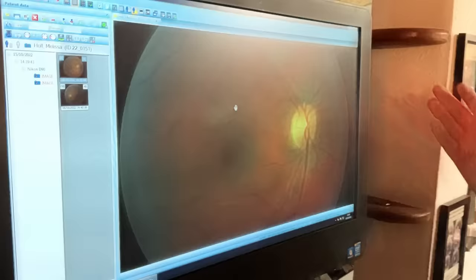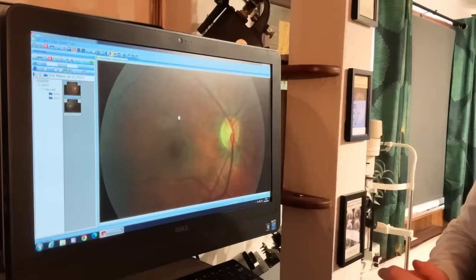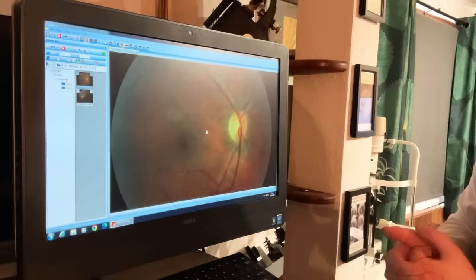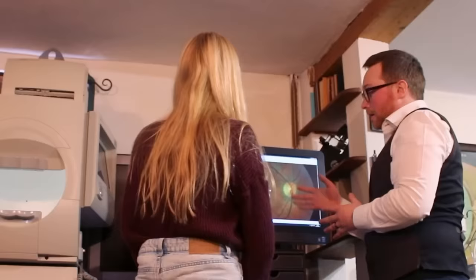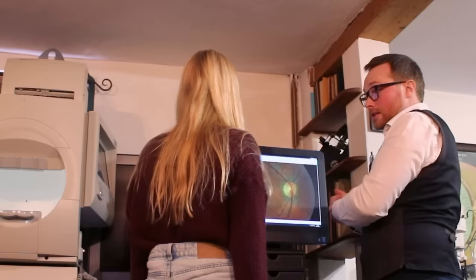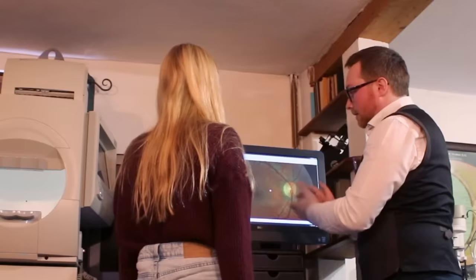So we've got the central retina here. When I have a look on the microscope, I will look further round. So the photograph captures all the really central, crucial structures. And this darker region here is called your macula. You might have heard of that with macular degeneration. So our macula is where we get our detailed central vision from. So this region here accounts for a really significant proportion of our vision. It's only a couple of millimetres across, but you're talking some 60-70% of your vision overall. So very sensitive, very delicate part of the retina. Again, also looking nice and healthy, so that's good.